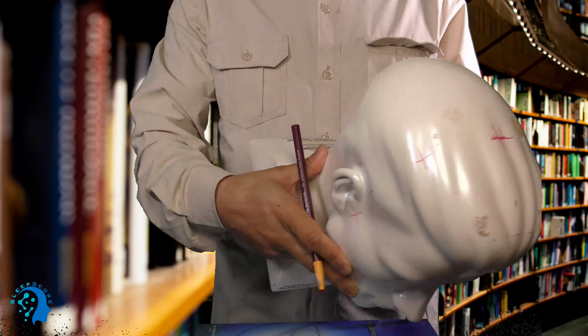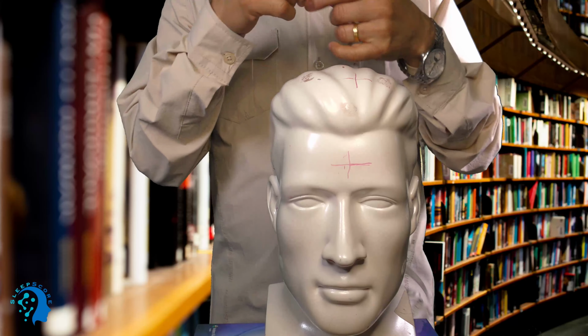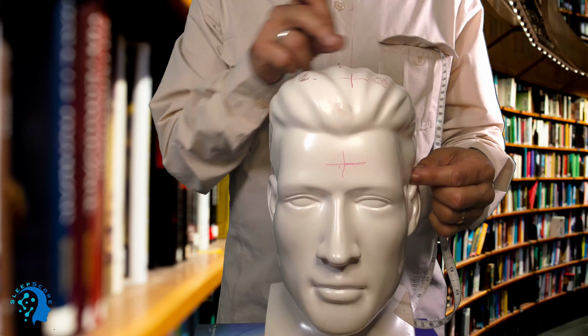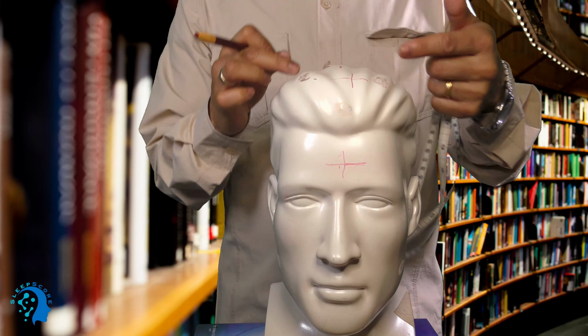I got Cz, and the left side C3, right side C4. Always remember, left sides are always odd numbers, and right sides are always even numbers. And when you measure like this, you have to make sure that all these 3 points are lying on the same imaginary line. It has to be straight. It cannot be zigzag, because when you measure correctly, it's going to be straight.